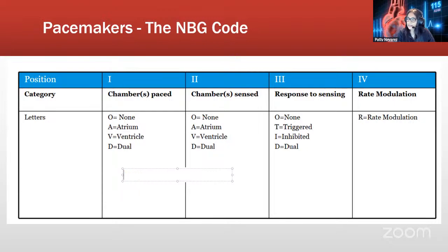Somebody asked in class, how long does a pacemaker last? Well, it depends. How much am I using it? How much time is it sensing? Because if the heart rate is going fine and not needing any support, or rarely, once in a while, then the pacemaker battery is going to last longer. Now, if it's constantly sensing and pacing and responding, especially the dual ones, then we're going to use the battery faster.